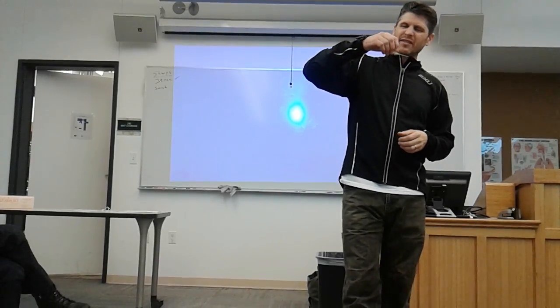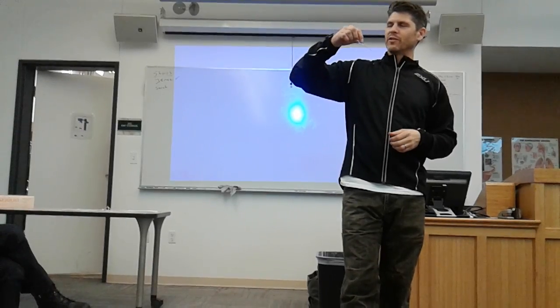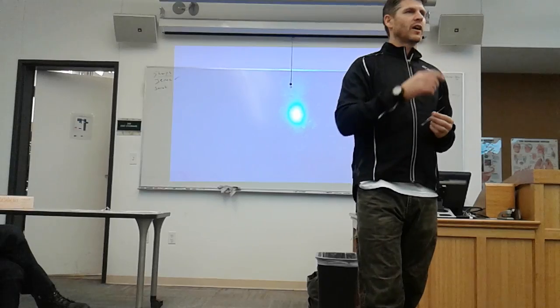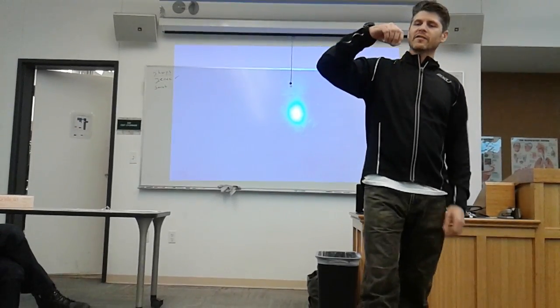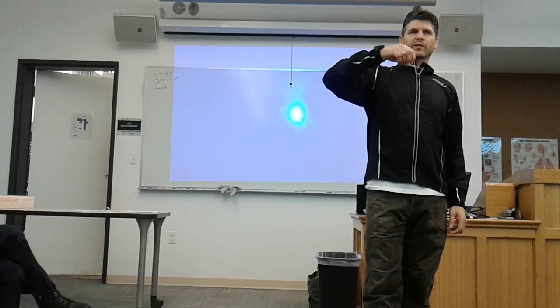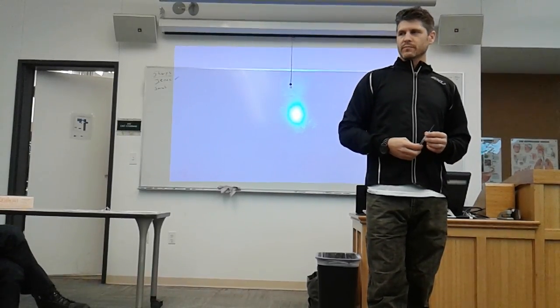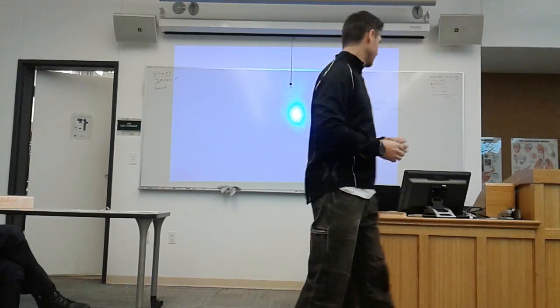Some of you are getting into that habit. You have a little bit of resistance when you push, and because of that resistance, it's less resistance to move backwards with your middle finger and thumb instead of pushing your forefinger off. And if getting that started is complicated, then stop doing it one-handed. Move to the other hand and start moving it forward with your other hand. That's perfectly fine. There's nothing wrong with that. Right? Questions?